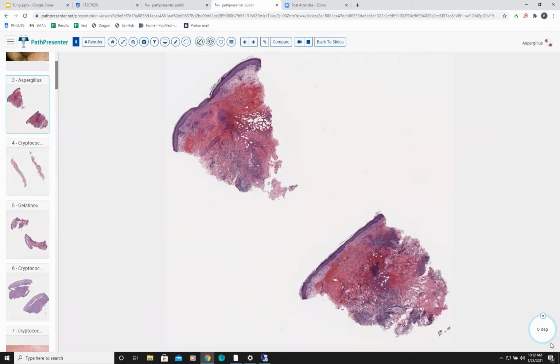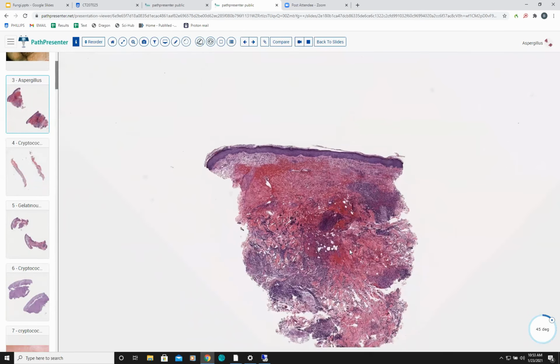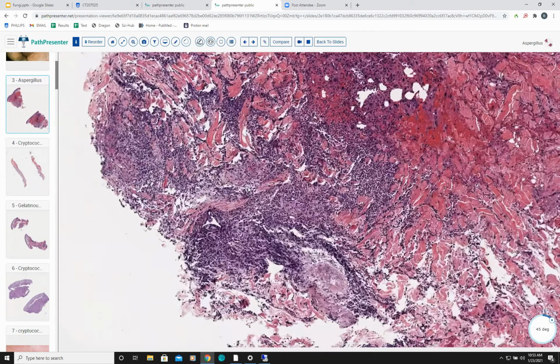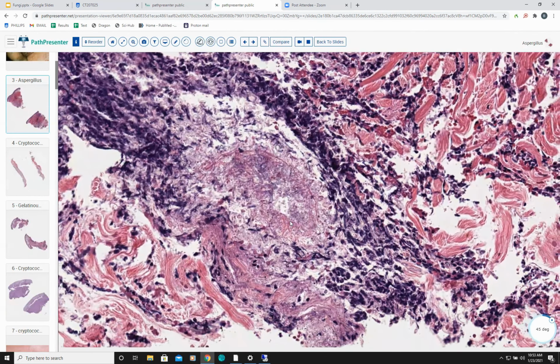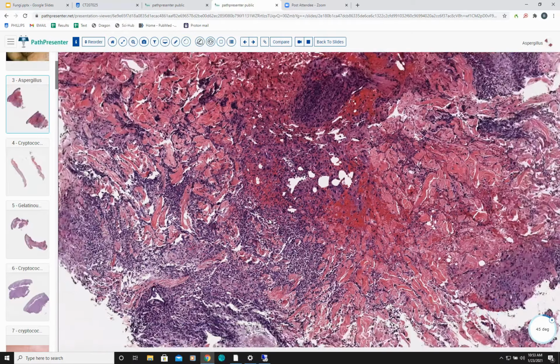And here is another case of that. And again, you see a normal epidermis, and this has got a lot of hemorrhage. There was probably vascular damage, an infiltrate, superficial and deep. And then when you start looking, the infiltrates neutrophils mainly, neutrophilic microabscesses. And then over here you can see these septate hyphae. And this is aspergillus, which has destroyed this vessel. And this is so clear, even on H&E, you don't really need a PASD stain to find the fungi.